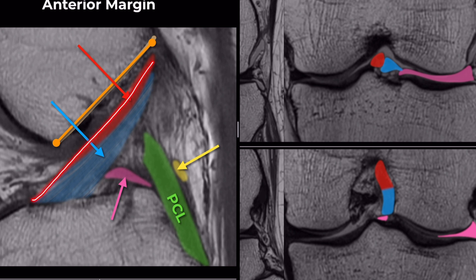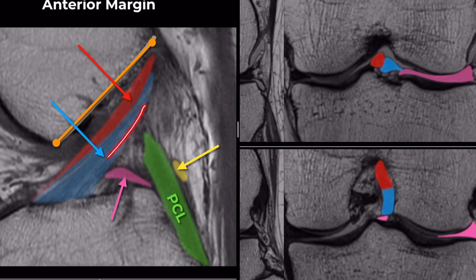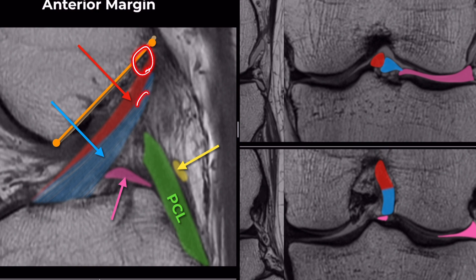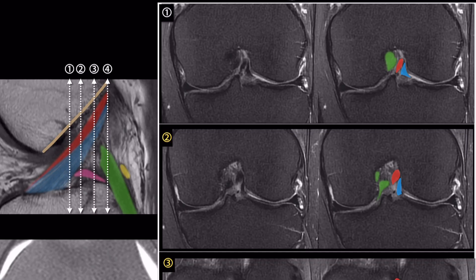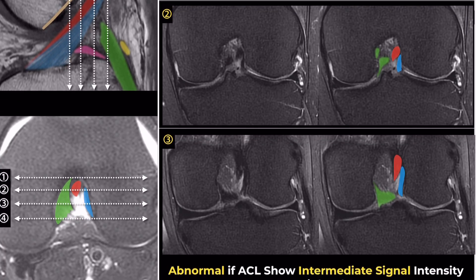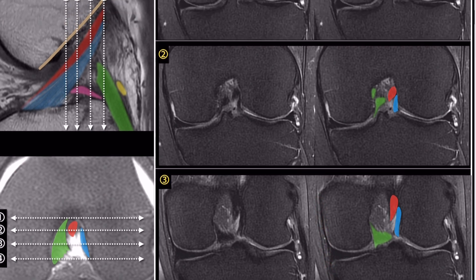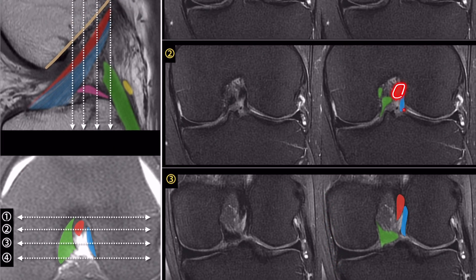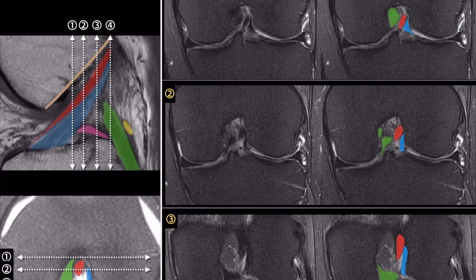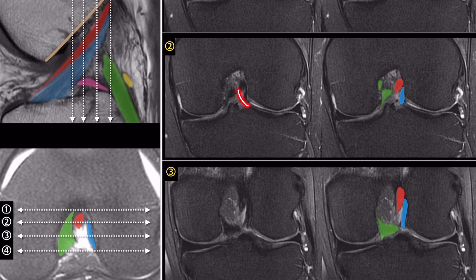The anteromedial bundle fibers originate from the anterior and proximal aspect of the femoral insertion, while the posterolateral bundle fibers originate from the posterolateral aspect. Therefore, the proximal anteromedial and distal posterolateral bundles are visible on the coronal image. Further posterior coronal images, especially at the PCL level and beyond, are important for evaluating the ACL because the proximal half of the anteromedial and the posterolateral bundle show a hypointense signal in the coronal plane.